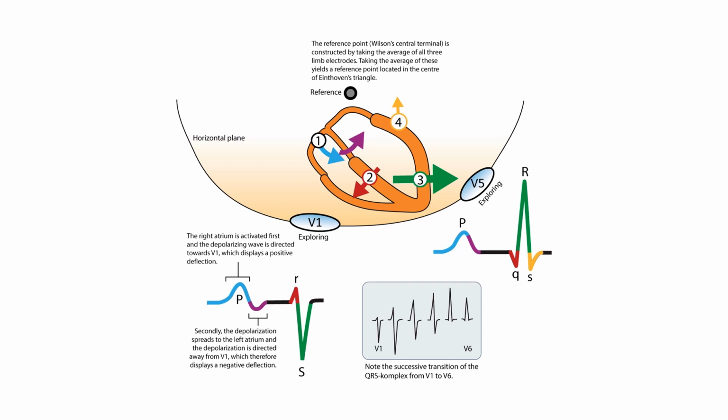What we could mention here is, if you have, let's say, right ventricle hypertrophy, then this wave would be much stronger, right? And what we see then, as we'll talk about later, is a big R in V1, which shouldn't be there, right? And we will have a big S because of the bigger current now moving this way. So it'll annul or at least balance out the bigger current from the left ventricle.